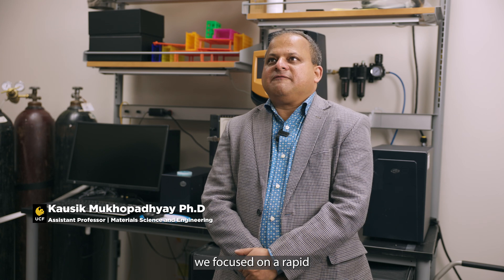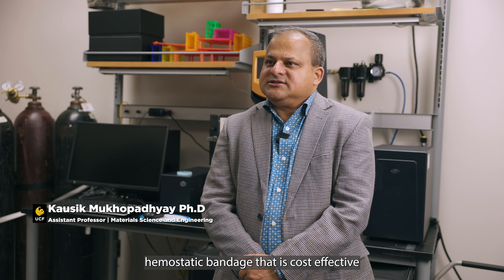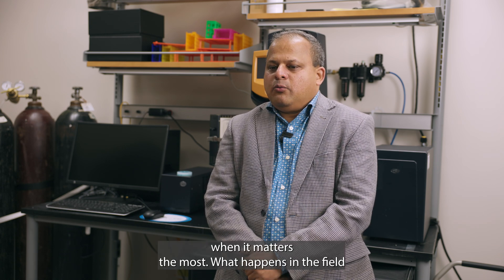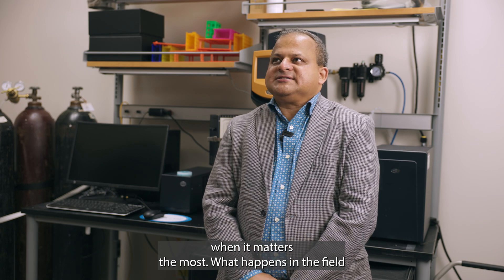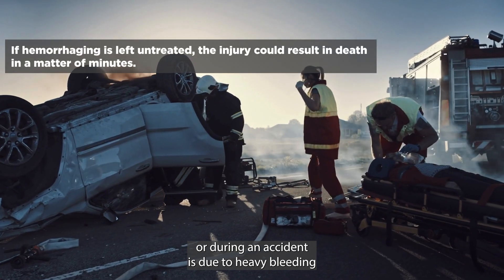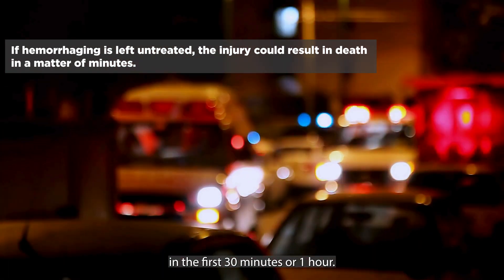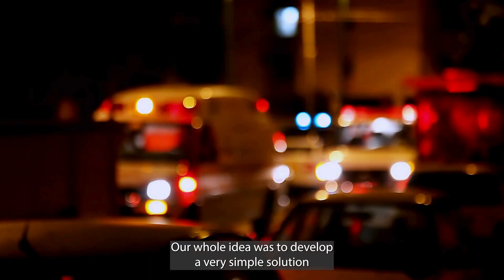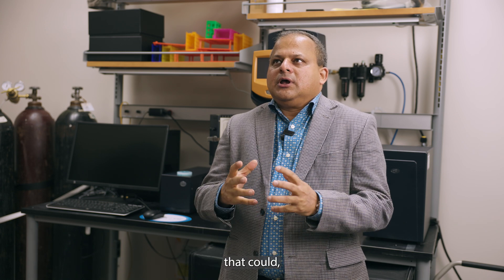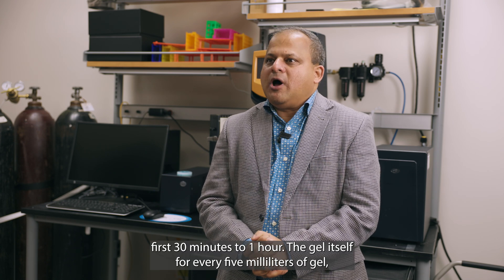For this particular study, we focused on a rapid hemostatic bandage that is cost-effective and can do the job when it matters the most. What happens in the field or during an accident is that due to heavy bleeding, patients die, and these fatalities usually occur in the first 30 minutes to one hour. Our whole idea was to develop a very simple solution that could have hemostatic efficacy within these first 30 minutes to one hour.